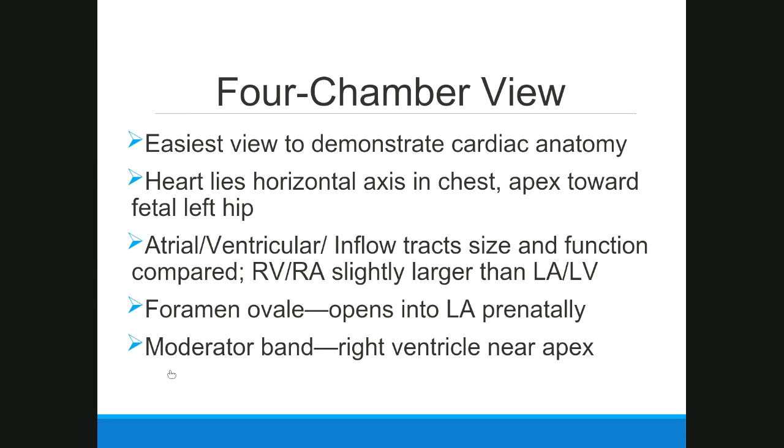It's one of the first things I look for in a 4-chamber view because it helps reassure me that I have my left and my right correct, and that what I'm seeing is a normal position of the heart, left and right are what I expect them to be. And I feel confident with that. Looking for the moderator band can confirm and reiterate your confidence in determining the left and right. And like I said, we'll look at a couple of images of what the moderator band looks like in a minute.